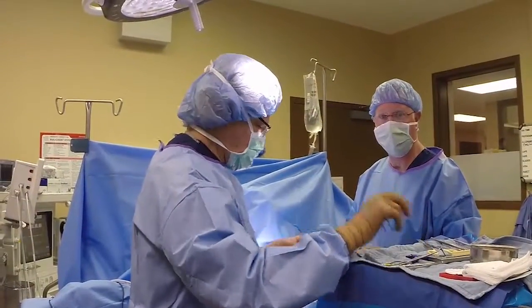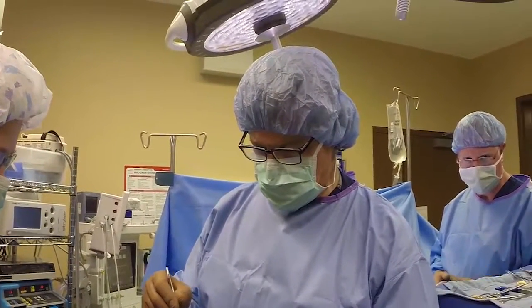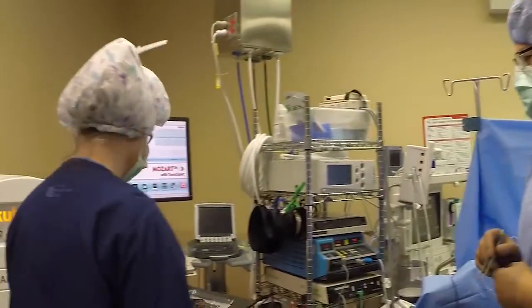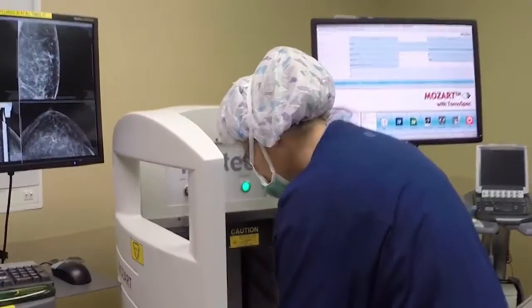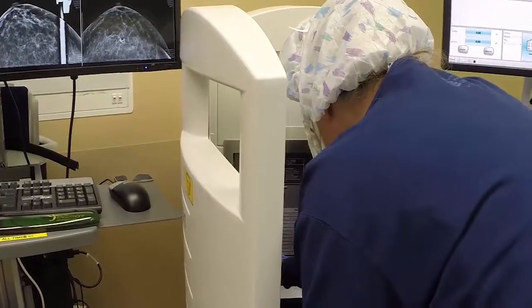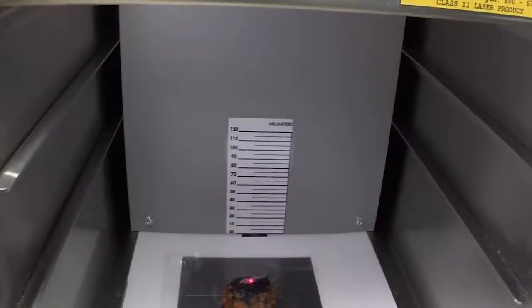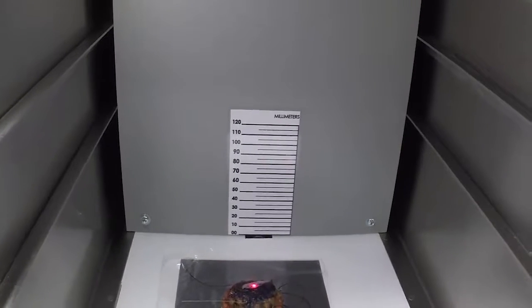So, we've marked the specimen. We're going to take the specimen and take an x-ray. I'd like to push the anterior top here down. Line it up. Can you show me the beam? The beam is right — where do you put the beam? On the highest point. You want it at the highest point, so when it does its measurement, it's correct.